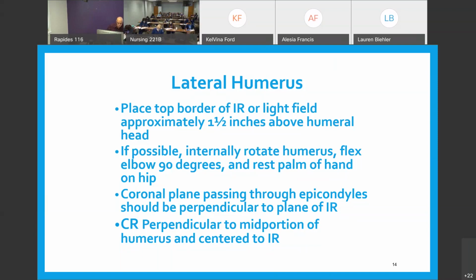All right. Respiration for all of this is going to be suspend. And what does that mean to a patient? Hold their breath? No. Suspend. Stop. Wherever you're at in the process of breathing, I want you to stop. And in our lab, that was one of my big drills, was it not?